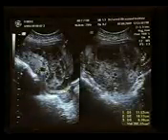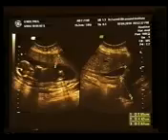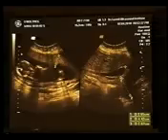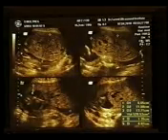Here it is molar tissue, but there was also hemorrhage and clots there. In this case, this was an alive embryo, and this embryo had a normal looking placenta, but the adjacent area also contained a thickened placental molar type of tissue. So there were twins. One twin was molar and one was normal.